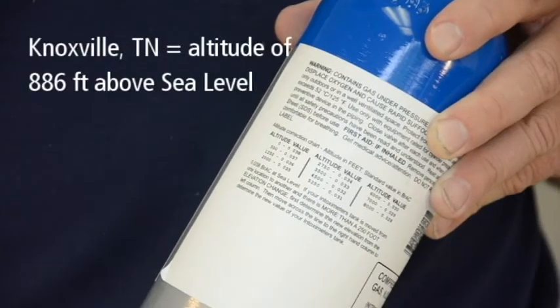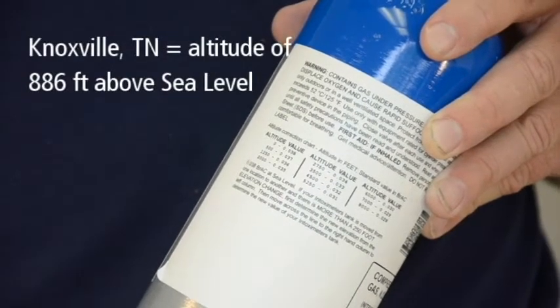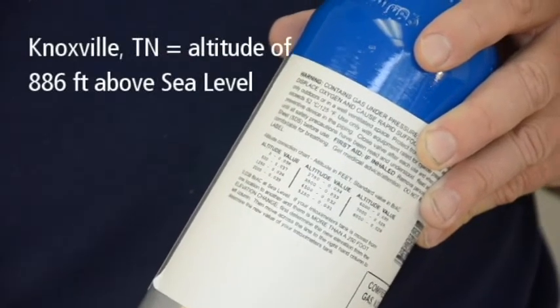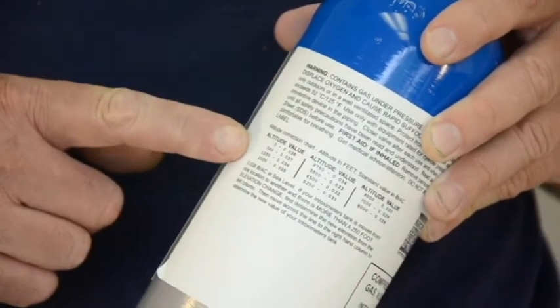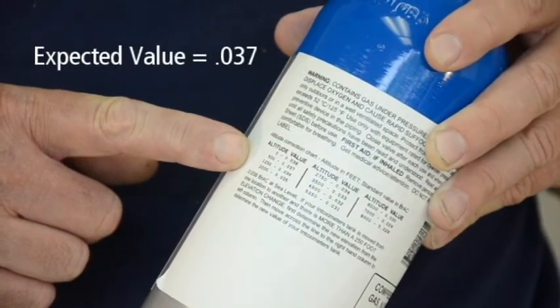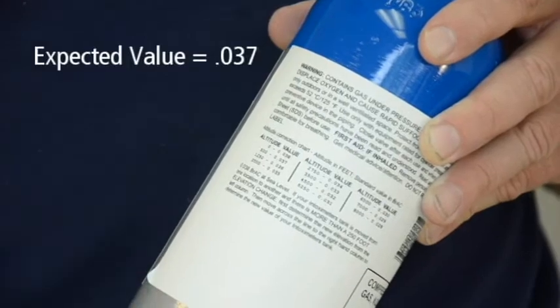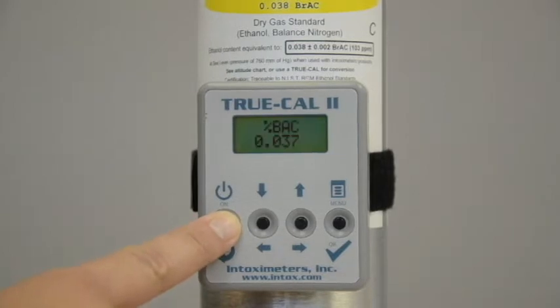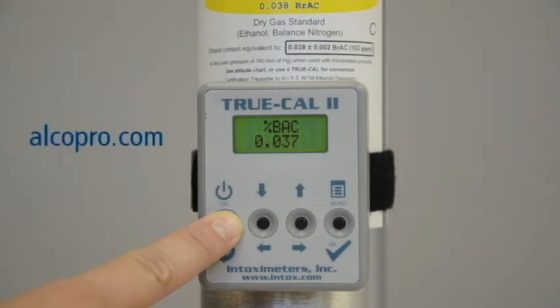For example, if you are performing an accuracy check in Knoxville, Tennessee, which has an altitude of 886 feet above sea level, the altitude chart shows the expected value of the alcohol gas tank to be .037. You can also derive the expected value by using a TRUE-CAL device, which uses atmospheric pressure to predict the expected value of the gas. You can purchase a TRUE-CAL device at alcopro.com.